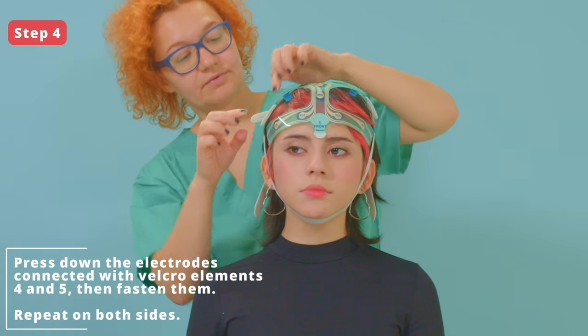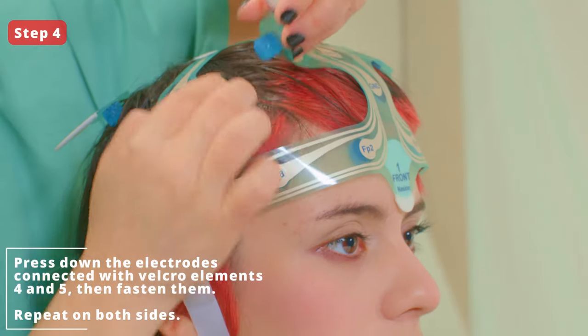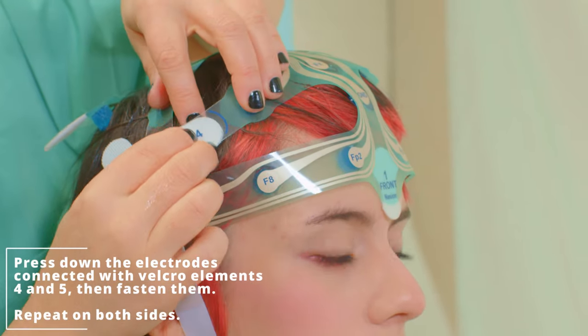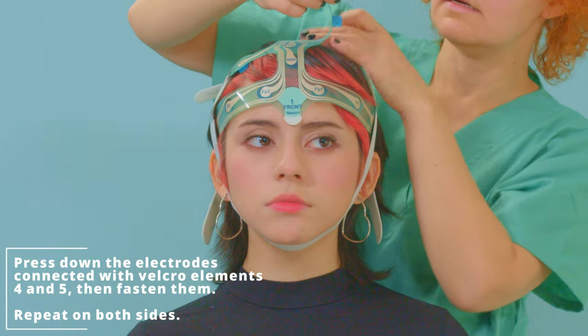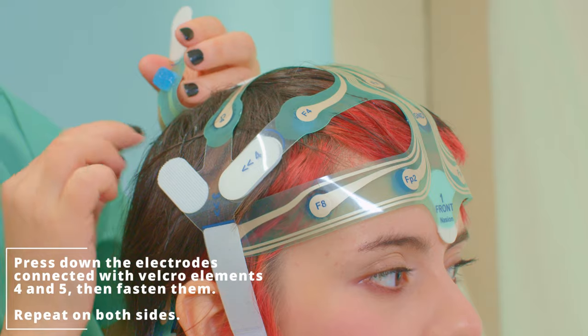Step 4. Place and press down the remaining electrodes, separating the hair. Fasten using Velcro strips with number 4 and 5 at the end of the strips. Repeat for both right and left sides.